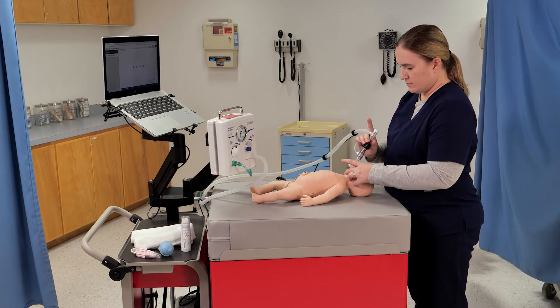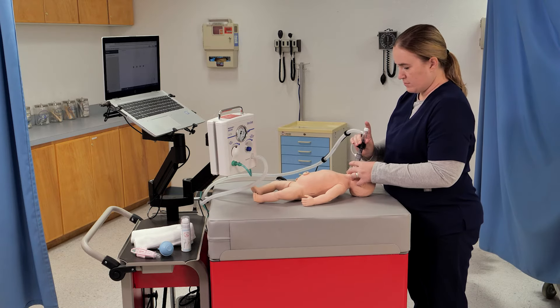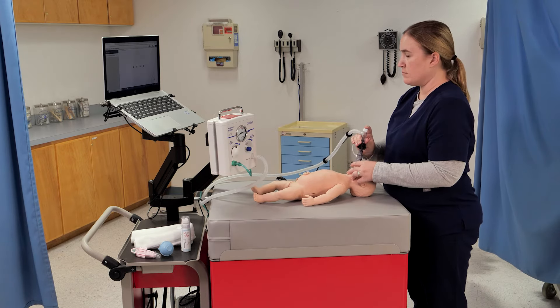Give 50 continuous ventilations to the mannequin. When you are ready, begin ventilating.